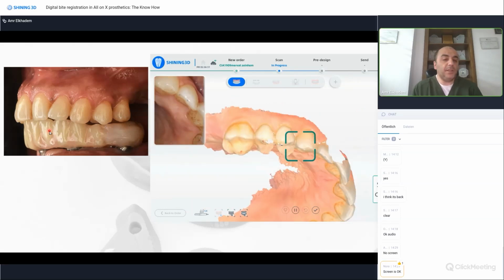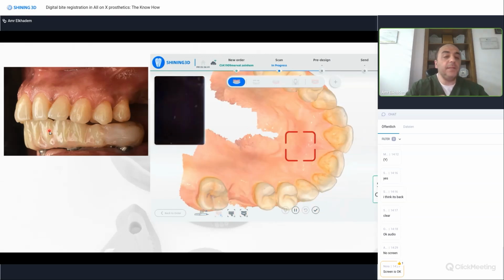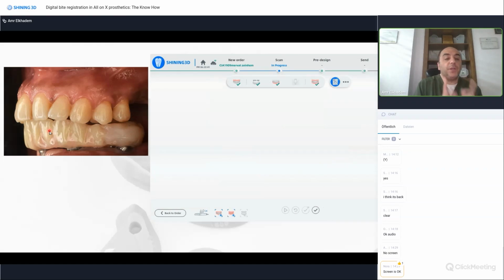if you feel that the bite is not correct, you can just do some minor occlusal adjustment with the articulating paper, adjust the bite with the vertical and the centric, and you can always use this to record a pre-operative relationship. And believe me, this is the best way.